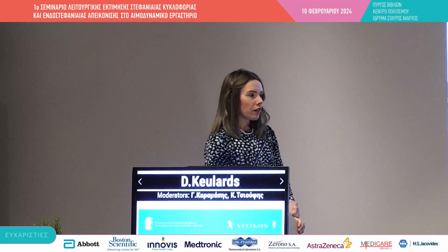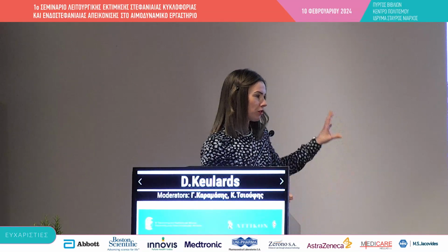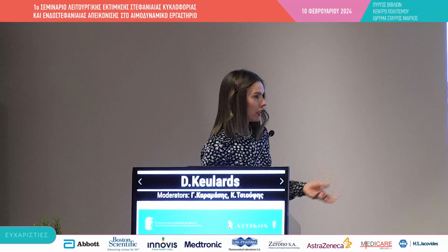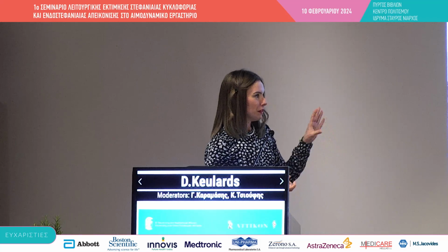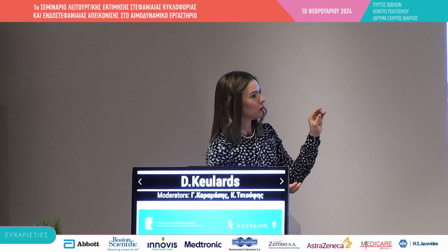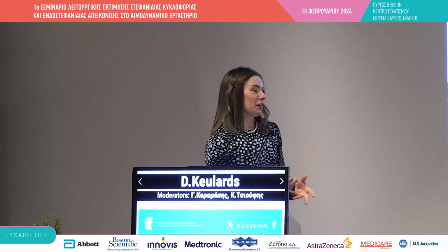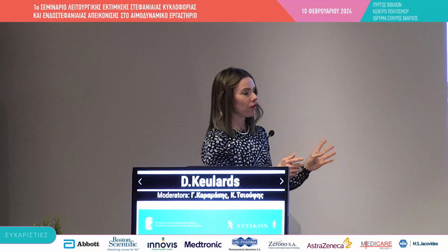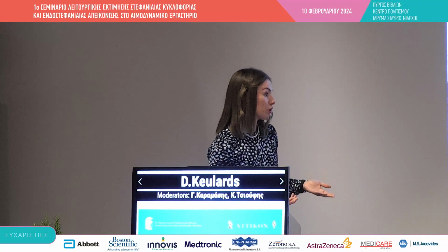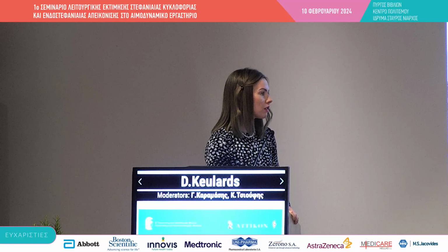Well, the first advantage is that continuous thermodilution is completely operator independent, because when you start an infusion pump, you cannot do anything. And with bolus thermodilution, you have to give the boluses yourself. The values that the person just showed are very equal, but you always measure 3 times and you can replace the values as you want. So sometimes you have a lot of difference between the values and then you're choosing which one to replace, which makes it less reproducible than this. That has been shown very extensively.